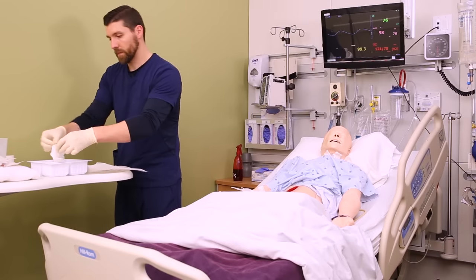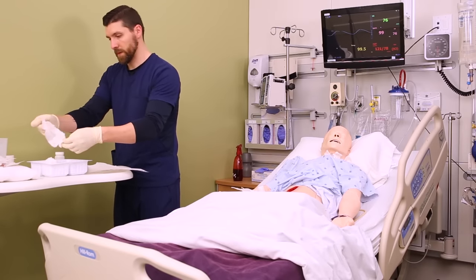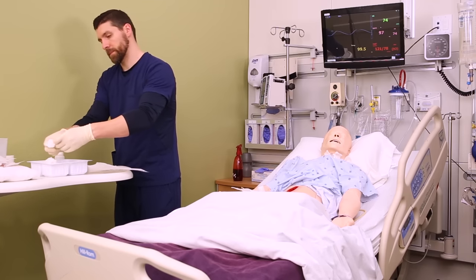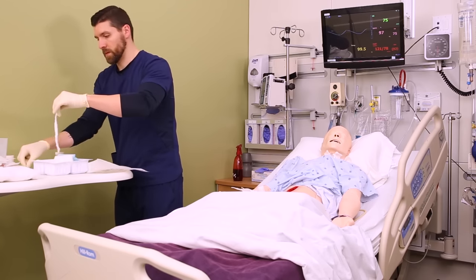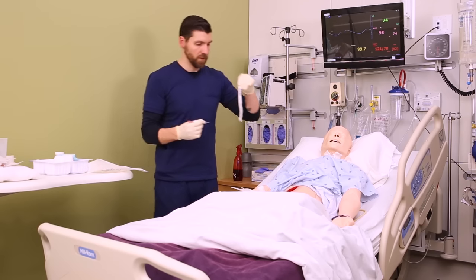Once you've soaked half of your gauze, pick up one piece of the saline-soaked gauze at a time, open it fully, and then wring it out. We want it to be wet, but we don't want it to be dripping wet. When we talk about selecting a dressing, we want the wound to be not too wet and not too dry, so make sure you wring out the excess saline.